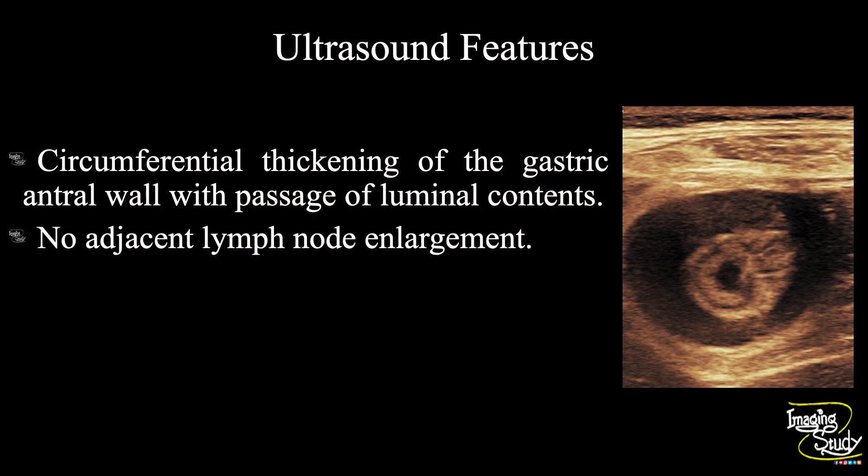In summary, circumferential thickening of the gastric antral wall is noted. There was no adjacent fat plane blurring or lymph node enlargement. So the diagnosis on ultrasound is gastric antral wall thickening.